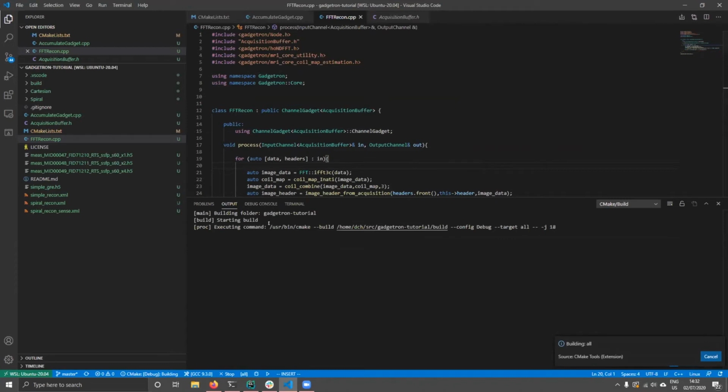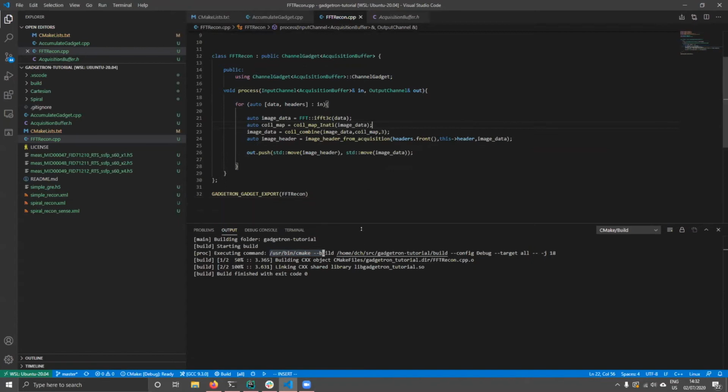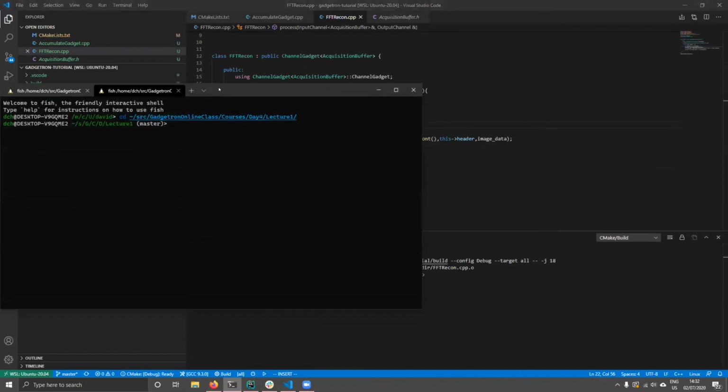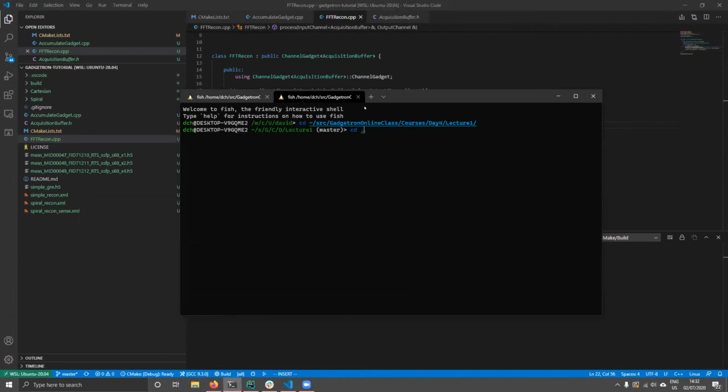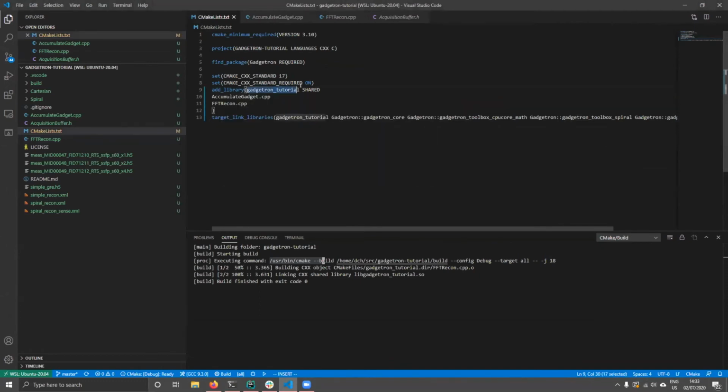So you can actually see what commands it's running. It's just running the build command of CMake. And now it is time to actually look at some images, see what's actually going on. I need to move these terminals a little bit because of our earlier problem. So inside the build directory, you can see we have our libgadgetron tutorial that matches with the library we made here, Gadgetron tutorial.